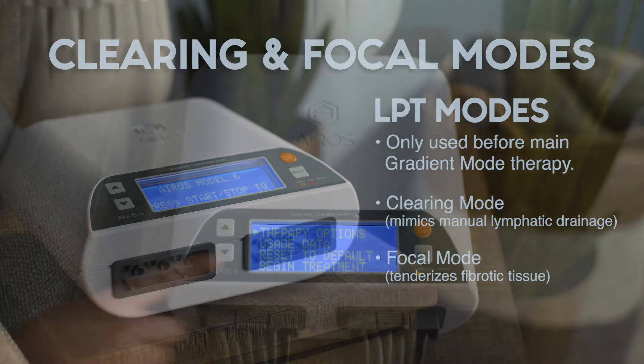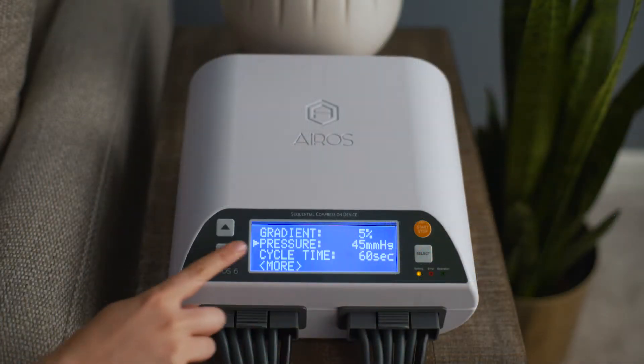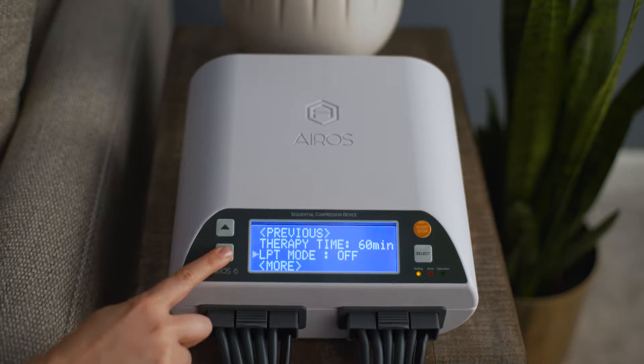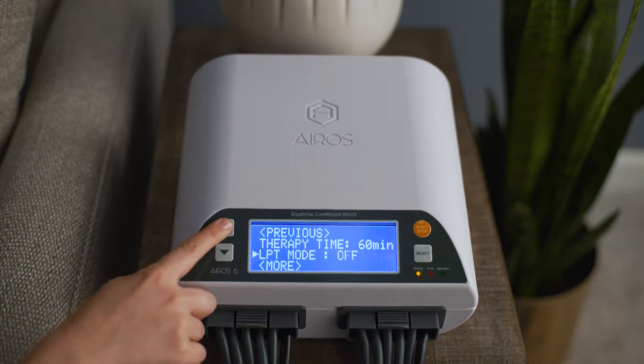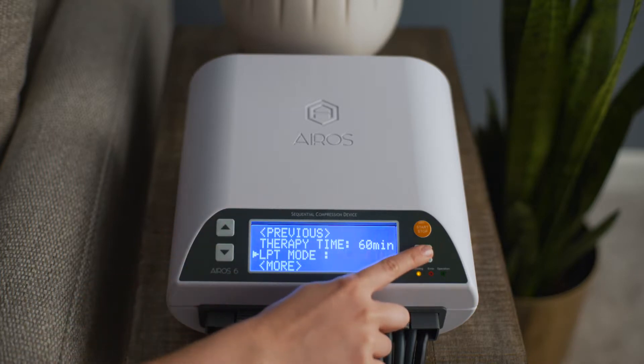To operate the device with clearing mode, from the gradient mode setup screen, scroll down to LPT mode and press the select button. The mode will start blinking. Scroll to clearing and press the select button.